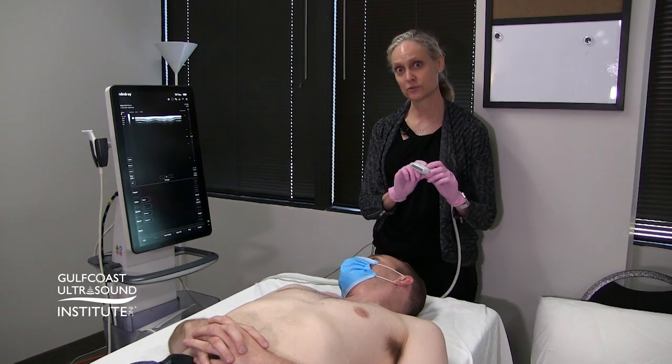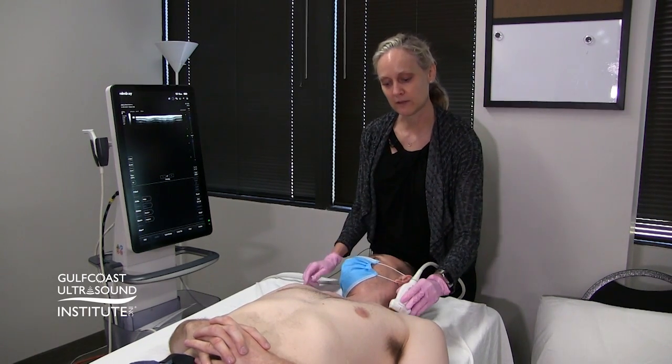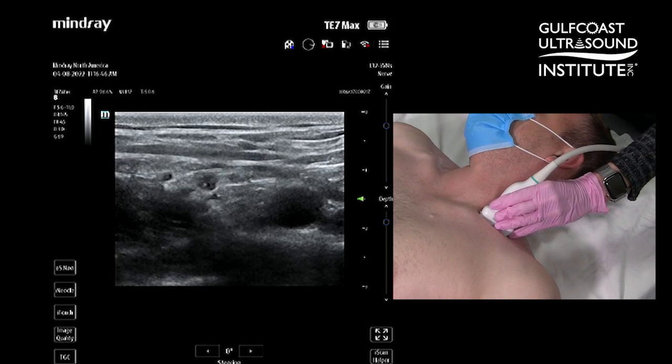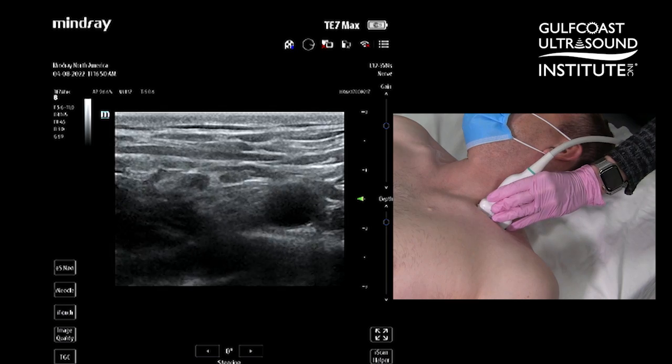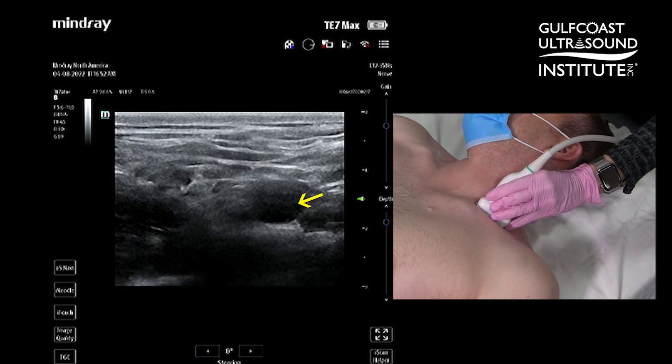Take your ultrasound transducer and place it parallel to the clavicle. Once you're parallel with the clavicle, aim your sound wave slightly inferior to find the round subclavian artery target.